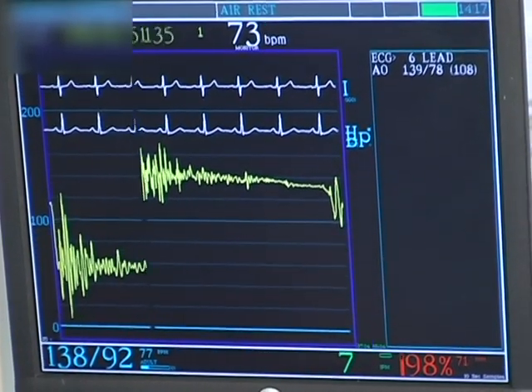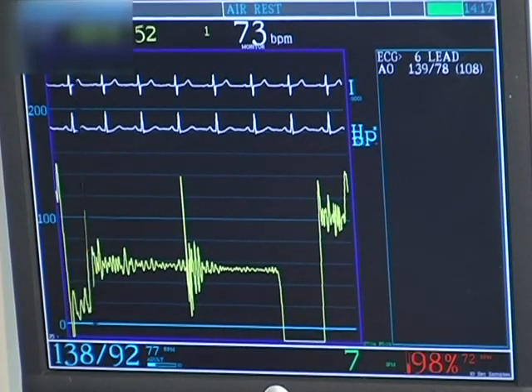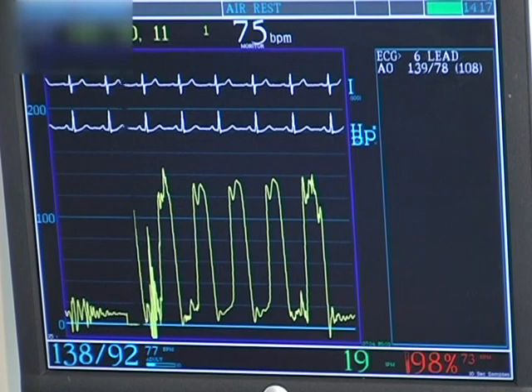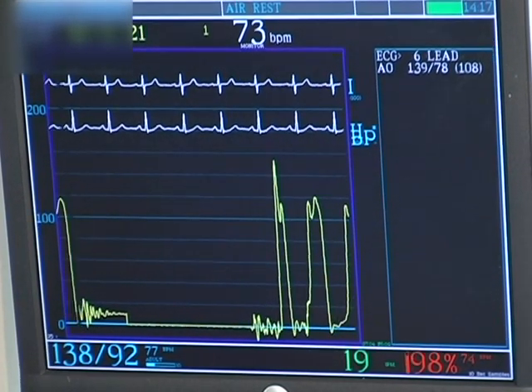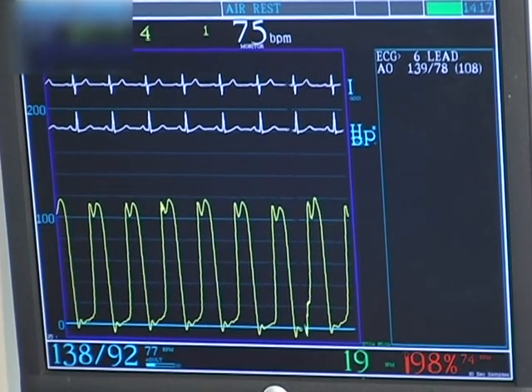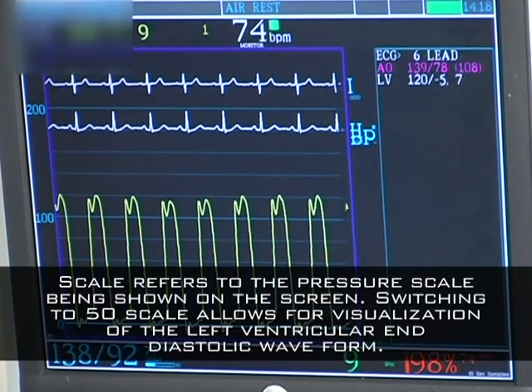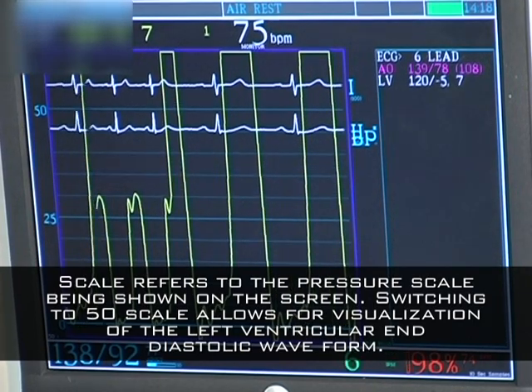Okay. Hang on. Okay. Let's have pressure. All right, here's our zero. Hands off. We're going to give you a zero first. Can you zero for me? Thank you. Pressure's up. So this is our left ventricular pressure, and we're going to talk more about hemodynamics in one of our subsequent sections on this video. Okay. Could you give me high scale, please, at 50? Thank you.